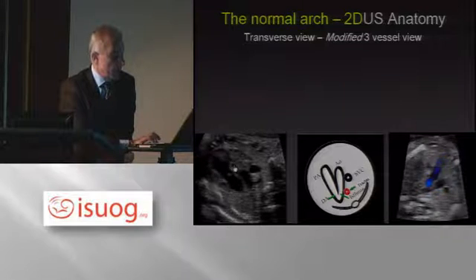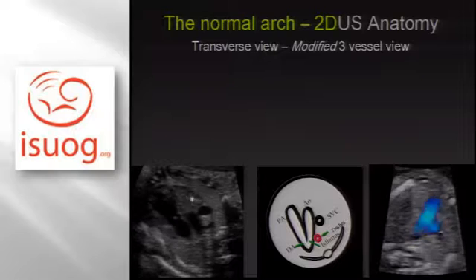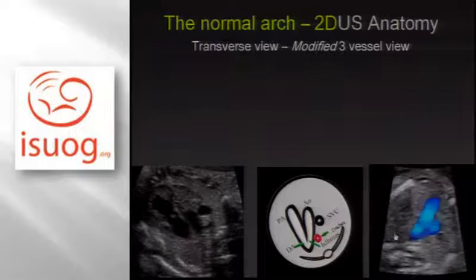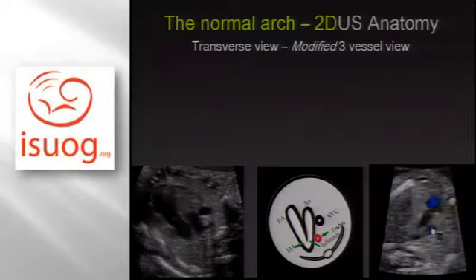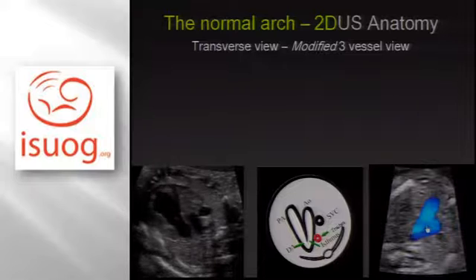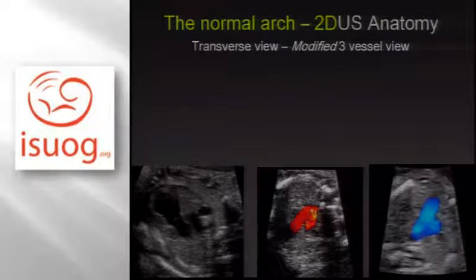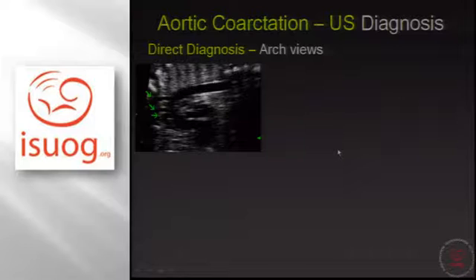And you see here on grayscale that you get the right pulmonary artery tract and the ductal arch and the aortic arch here, a bit of the thymus. This was a third trimester baby with the thymus very, very large, the superior vena cava and the trachea here. And with the color Doppler, you can actually make out the two arches, ductal and aortic, which are similar in size, and the trachea is on the right of the two arches. And also with a posterior approach, you can have this kind of blue or red V shape. And both branches should have the same color to exclude ductus dependency.